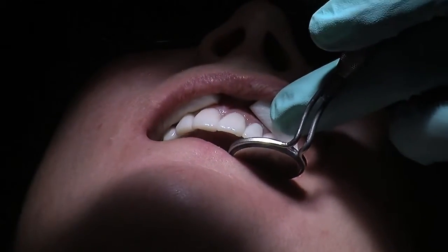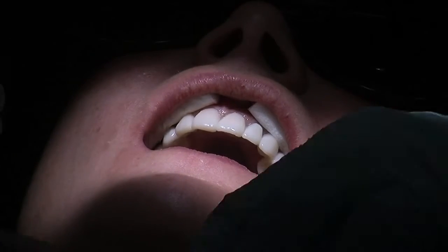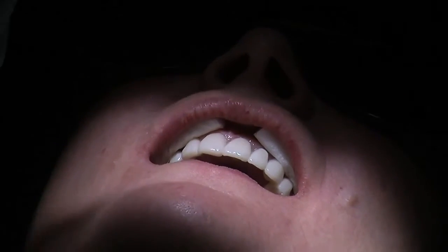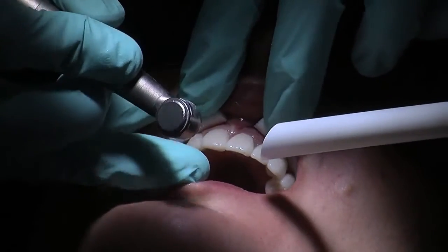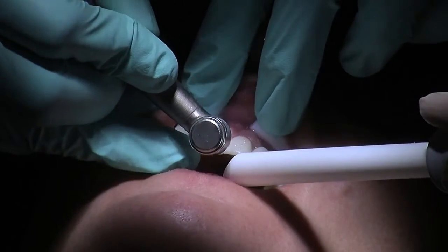Then I'm going to switch to the fast handpiece using this flame-shaped burr, very thin burr. Have some suction please now. A little bit of gentle drilling now. I'm just adjusting the temporaries slightly, okay? So close slightly, and put it over. So a little bit of drilling.